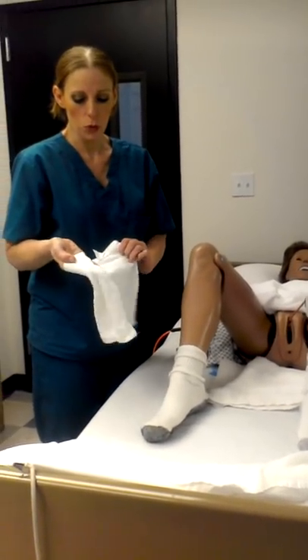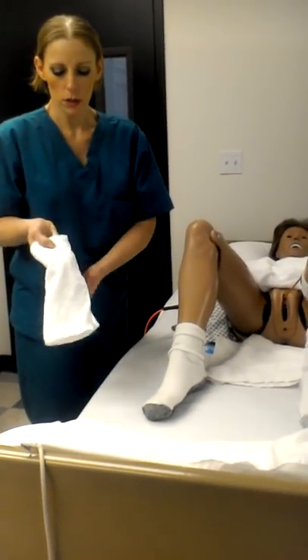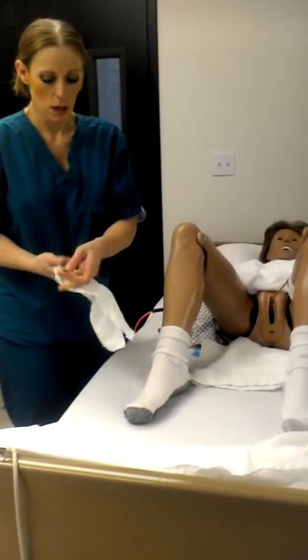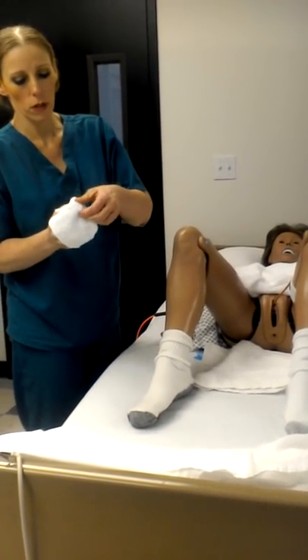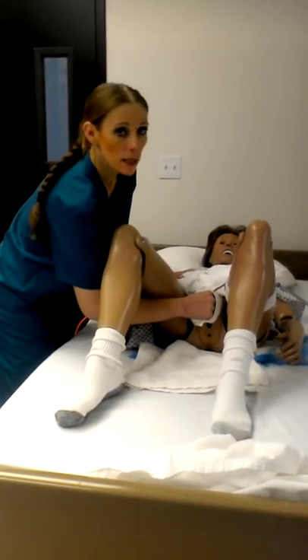Normally you do it opposite, so when you make a regular mitt it looks like this. When you're making this mitt you're doing it towards the pinky and folding it towards the thumb. So when you tuck it in, put your gloves on, you pull that piece out so you have that room to clean around the catheter like this.